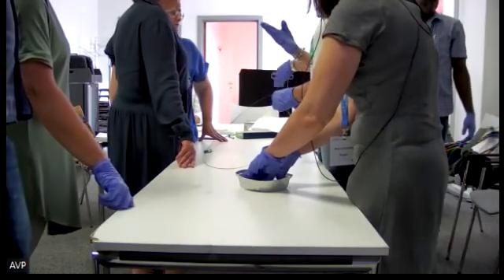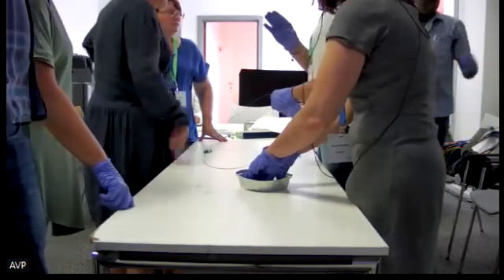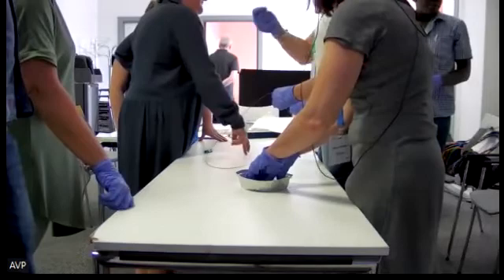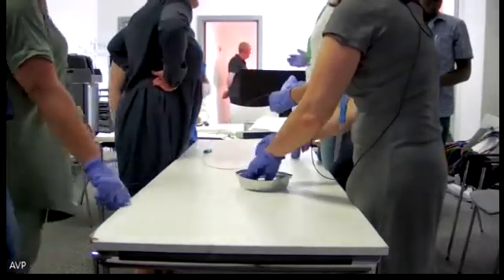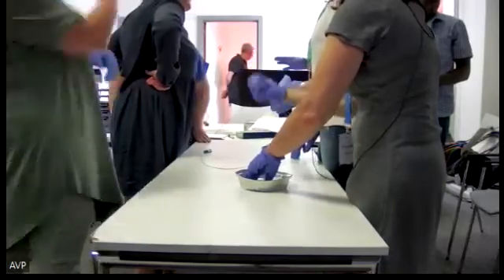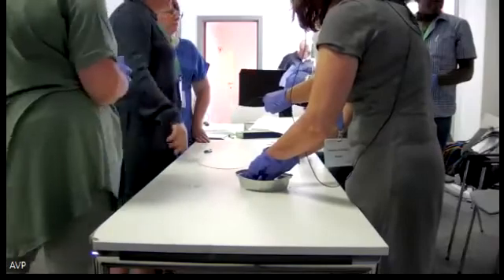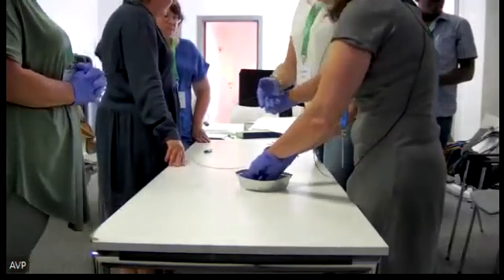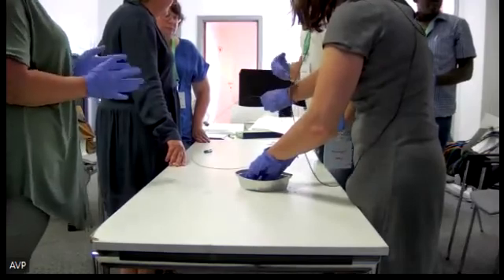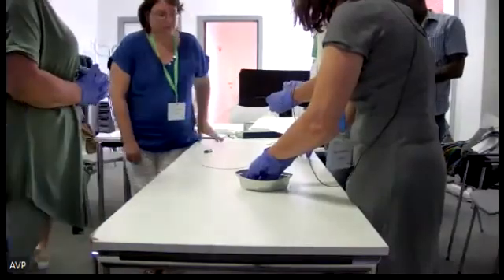Why? Because with the pigtail stents, it's very difficult to use this fusion system because of the curve. It's difficult to release the guide wire inside. If you release it, everything goes, the pigtail is formed. Otherwise, if you want to push a straight stent, then you can use the fusion system, and you don't have to double the wire.